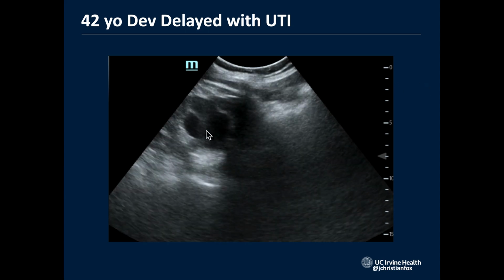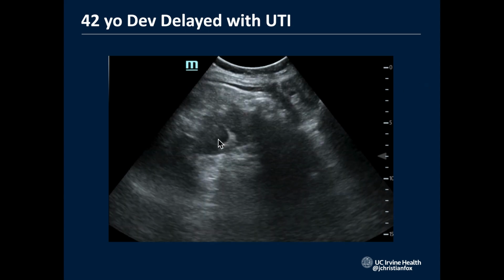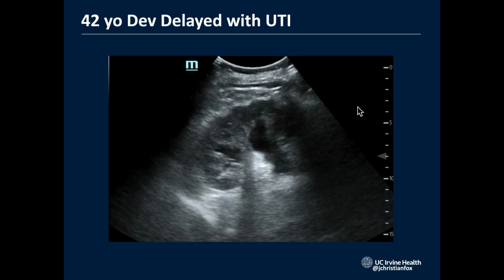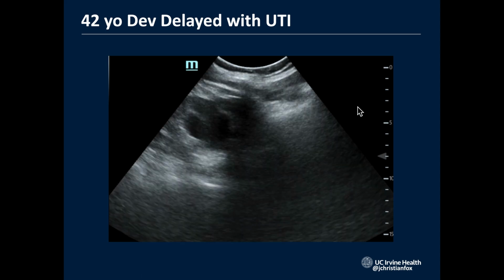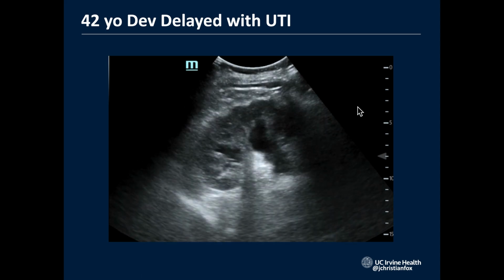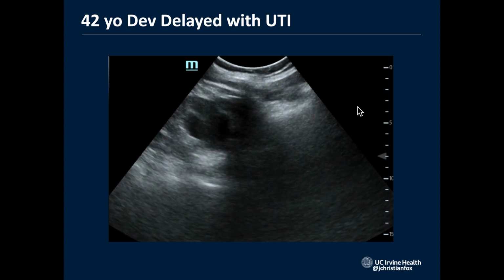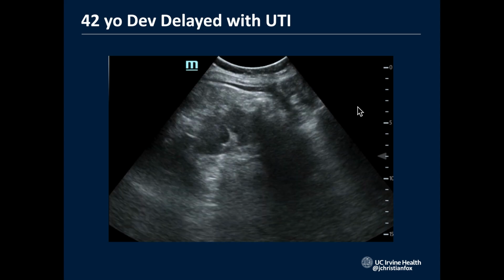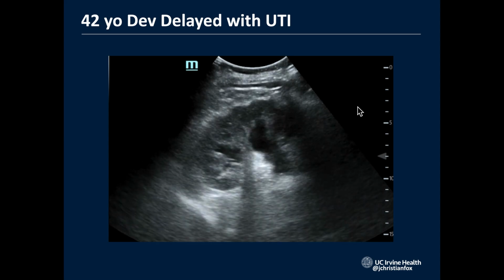And I look at his kidney with ultrasound, and he's got all this obstruction here. He's got basically a moderate amount of hydronephrosis. I said, does he have any history of kidney stones? They're like, no, doctor, just infections. Ready for our antibiotics? We want to go home now. I said, no. I'm seeing a dilated kidney here. It looks like it's obstructed. He could have a kidney stone that's infected, showering blood and bacteria into his blood.